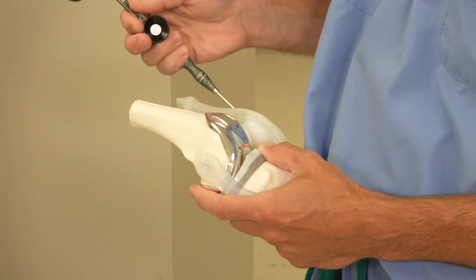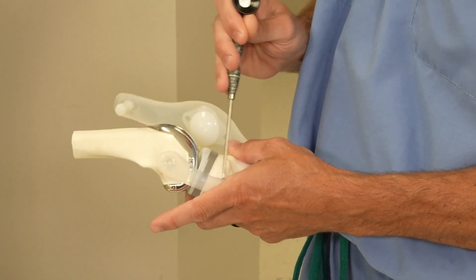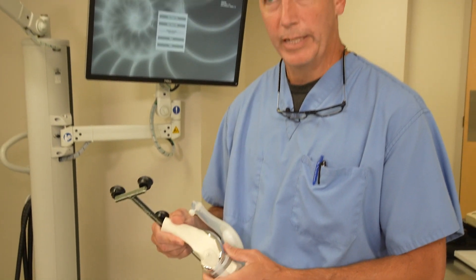Once the joint replacement is in, we do the final steps. We do a pain injection all along here, across here, around here, and down along here. That is a long-lasting pain medication that ideally will last three days — in reality it's more like two days — and it works very well in allowing us to do this surgery on an outpatient basis.